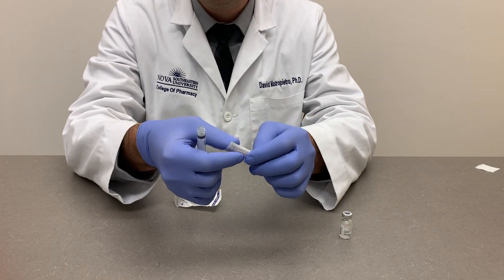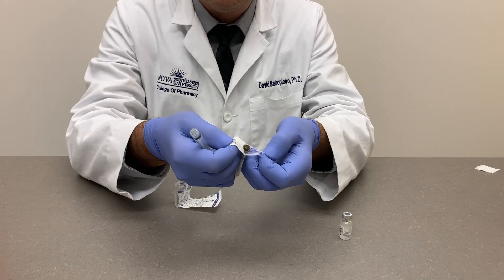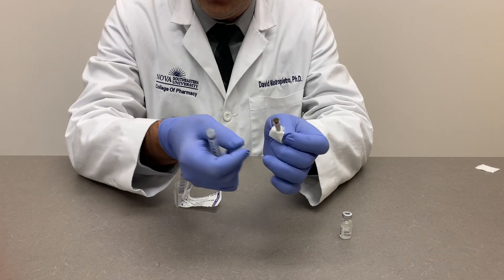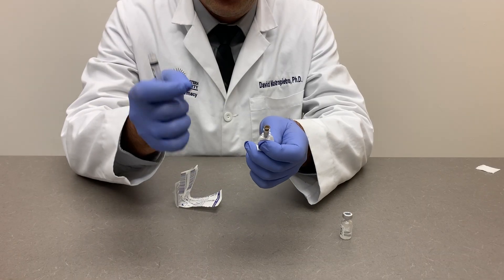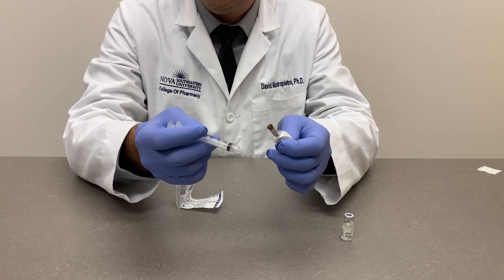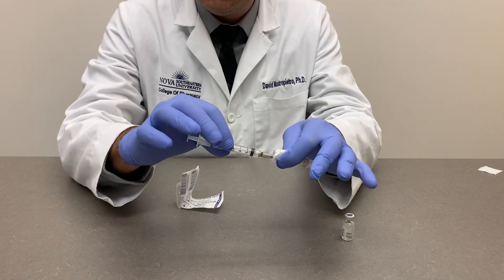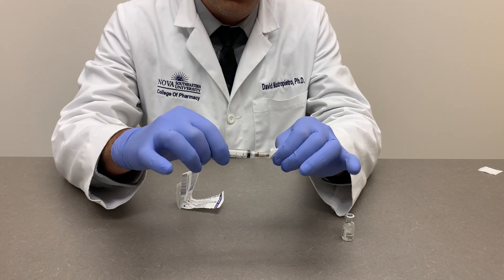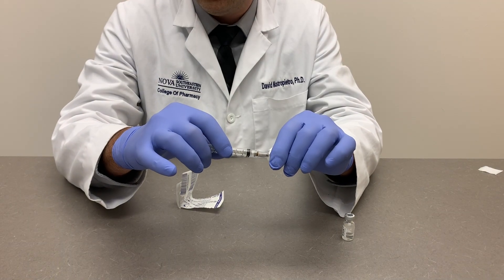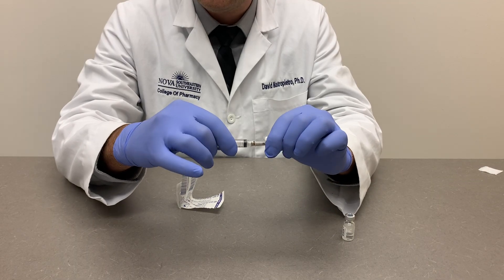Remove the needle from its packaging in the same fashion by peeling it open from the manufacturer-specified end. The hub of the needle is a critical point that should not be touched by fingers or surfaces. The attachment of the needle to the syringe is by a luer lock — it's twisted into each other. Make sure you don't over-tighten it, but it should be firmly attached.